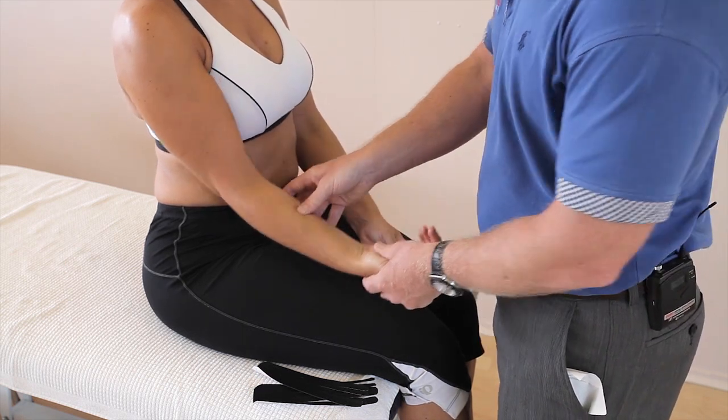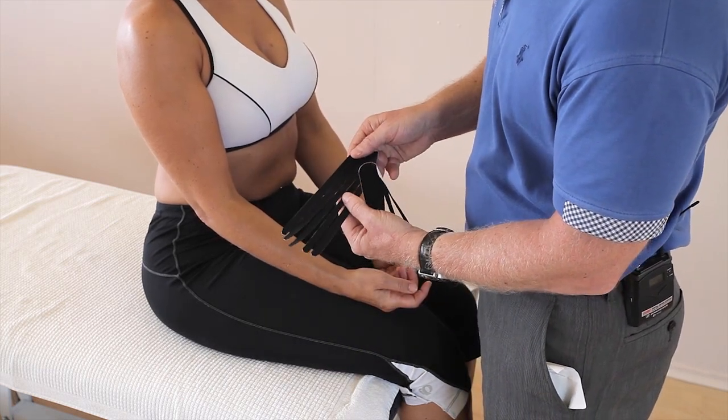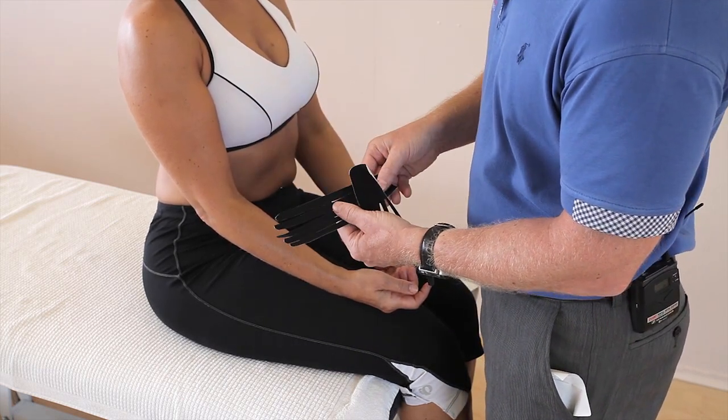The tape you're going to be using is two eye strips and I've pre-cut them into five individual fingers and I've rounded off each of the ends.